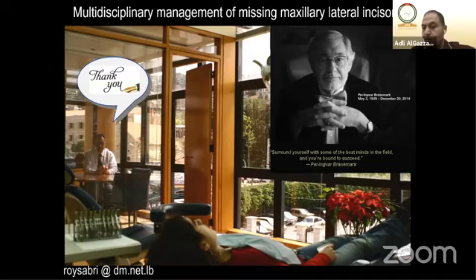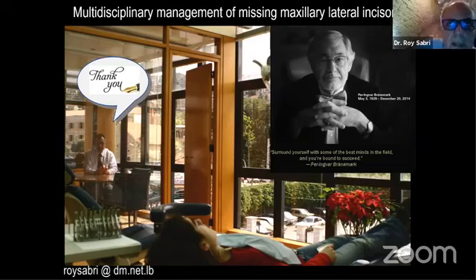Now, TADs do have something specific with mesialization. Now I can mesialize the posterior segments, especially with palatal TADs, without even retracting 1 millimeter of the incisors. So this facilitates for me the closure of spaces without any retraction, and this is what I mean.